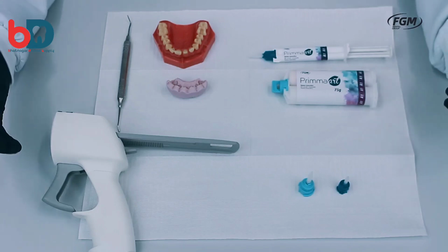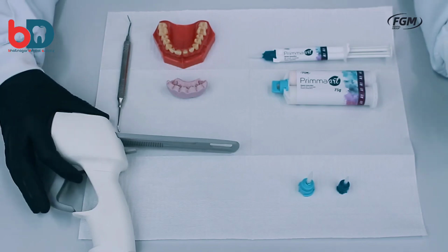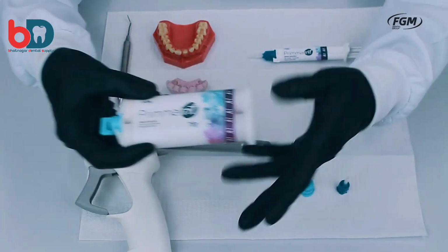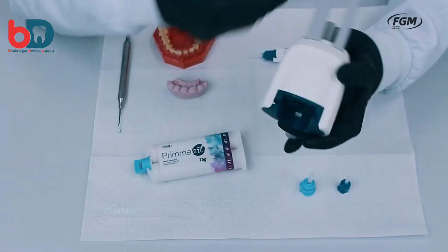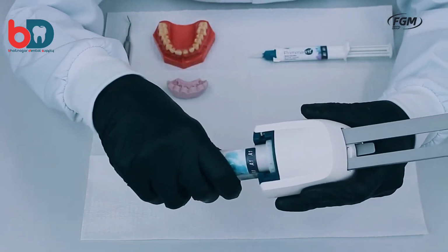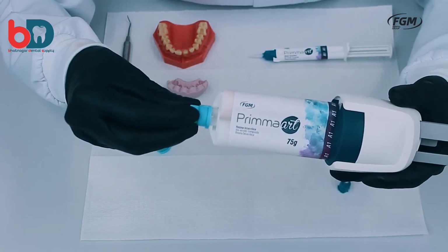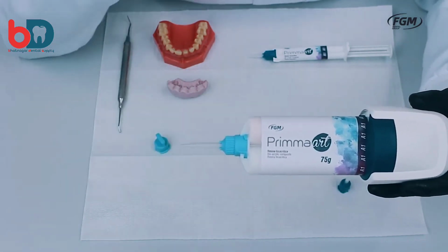In this case, we're going to make one single temporary crown for an anterior tooth. So in this case, we're going to use the cartridge. Well, it's very simple. We're going to use the universal dispensing gun in the 1:1 proportion. It is compatible with any dispensing gun available in the market. Remove the lid and introduce the self-mixing tip, which is small but allows for excellent mixture of the material.